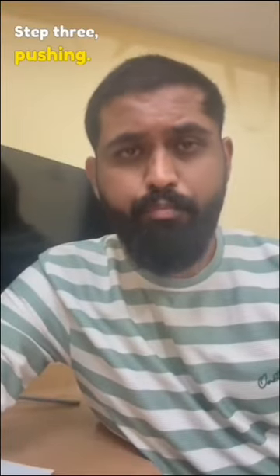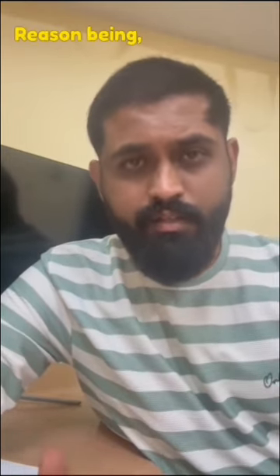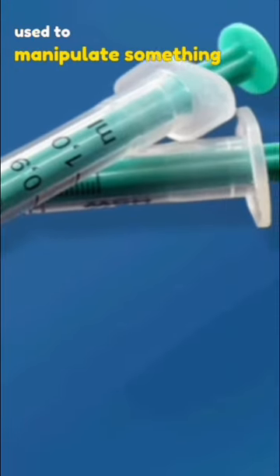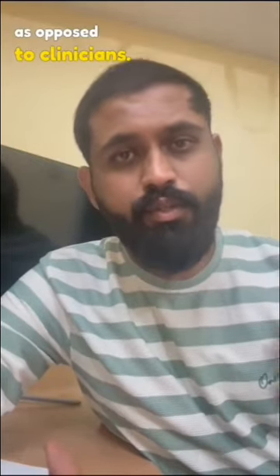Step 3. Pushing. In my opinion, pushing should be performed entirely by the embryologist. Reason being, a BD syringe is a macro instrument used to manipulate something that is at a micro level. This is something embryologists are really good at as opposed to clinicians.